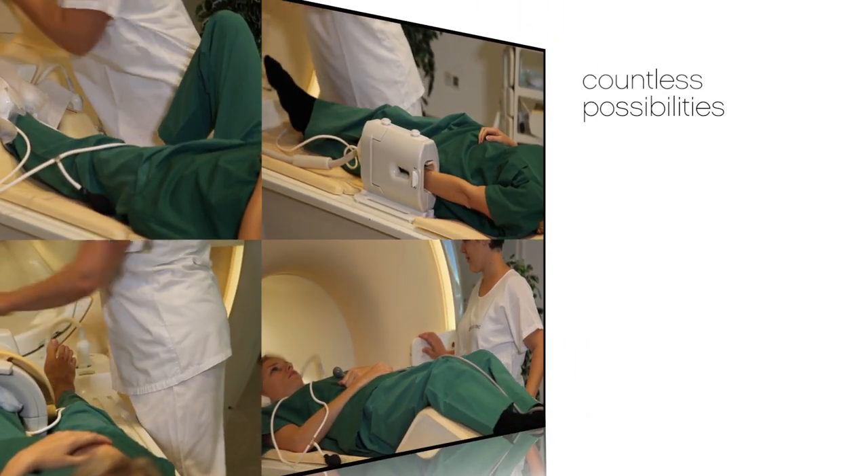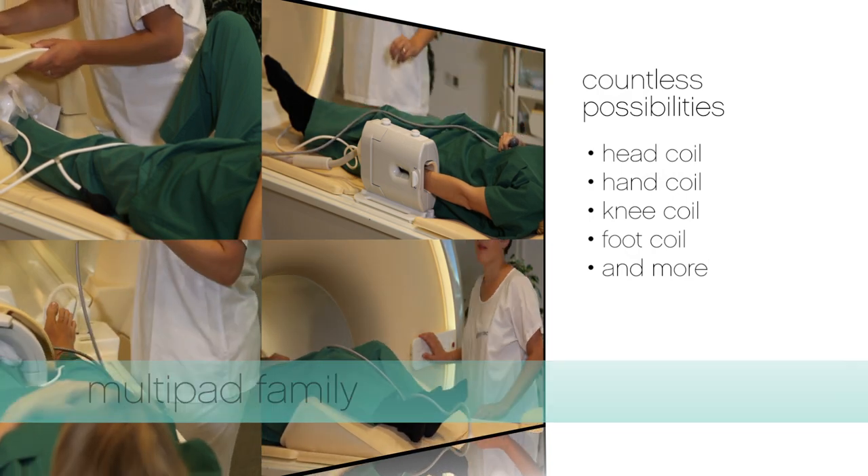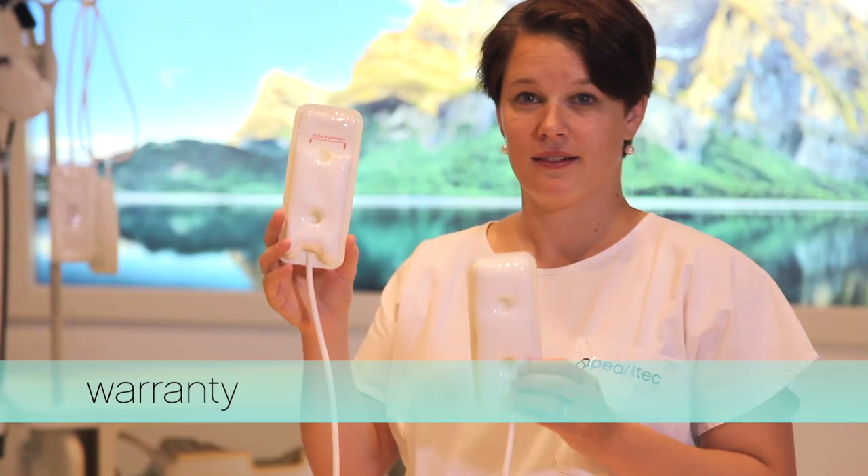The pads offer you countless possibilities with one system. To guarantee the multi-pad's high functionality, we've designed a replace product indicator. When you see the red line, you know that it's time.